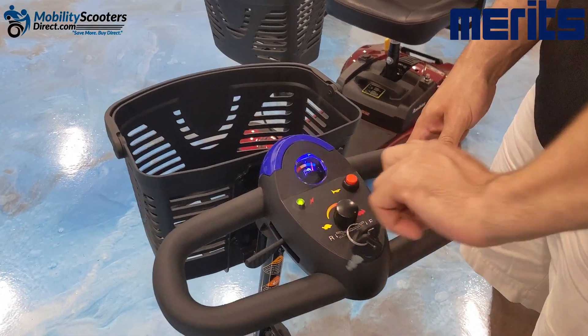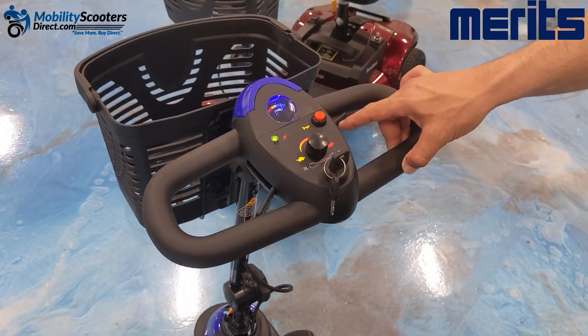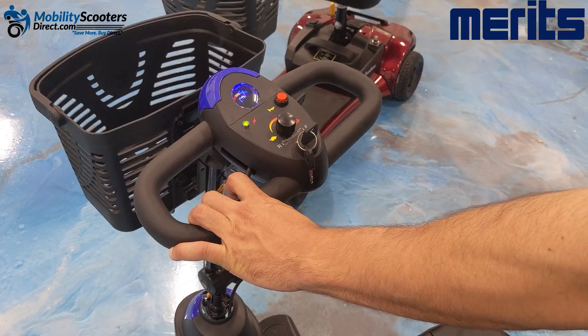To turn the scooter on, simply put the key in the ignition and turn it clockwise. As you can see, it has a delta tiller which can be used with one hand independently — you don't have to use both hands.